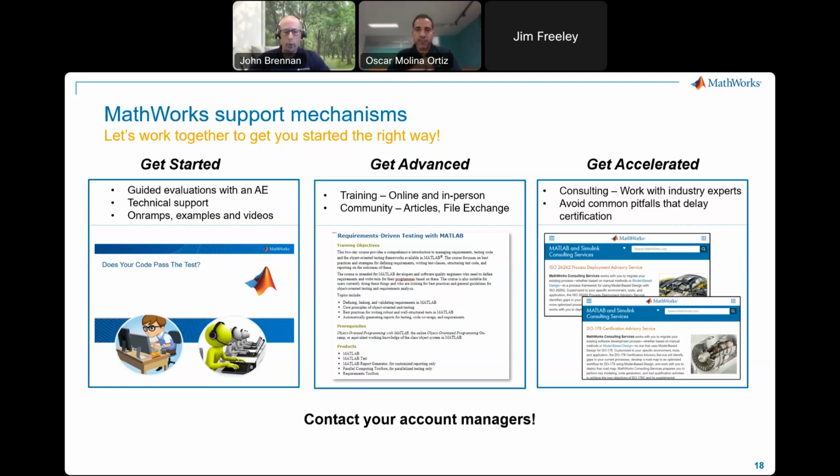And I think we have time for one or two more. So is MATLAB Test available only for project-based applications? It is, and I would actually recommend you guys, if you are working with many functions, many artifacts, to use MATLAB projects. It's the best way to organize your code. It's an agnostic structure of your code that you can use no matter which MATLAB or which computer you are using or working on, because you will always get the same structure very consistently.